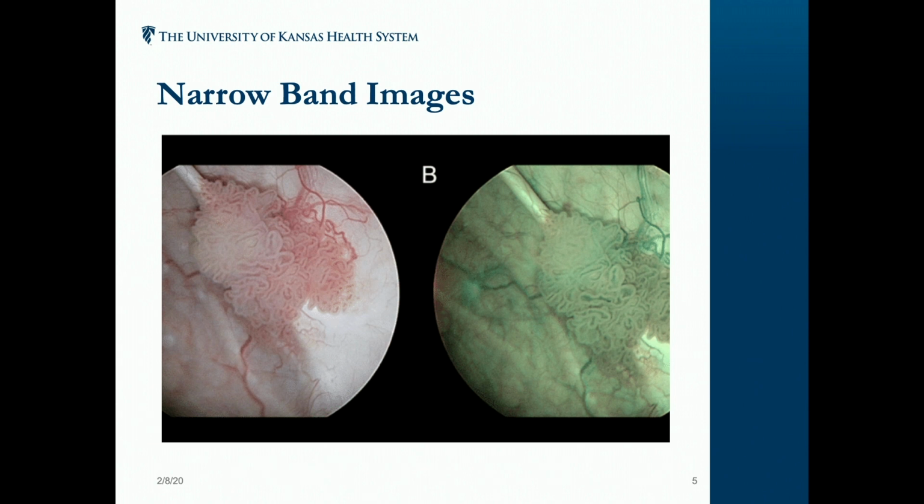Now, I don't use NBI, and I'm not going to talk about NBI a lot, but I know that a lot of people use NBI, and I have no problem with using NBI. It's a lot less expensive. It's oftentimes built into the equipment. It doesn't require a dye. I get all those things. My limited experience is it's not been as good as blue light. And the data on NBI probably doesn't look quite as good as blue light, but just so you know, there have not been any head-to-head trials. So I'm not here to disparage NBI or really talk more about it, but here's an example of what NBI would look like.